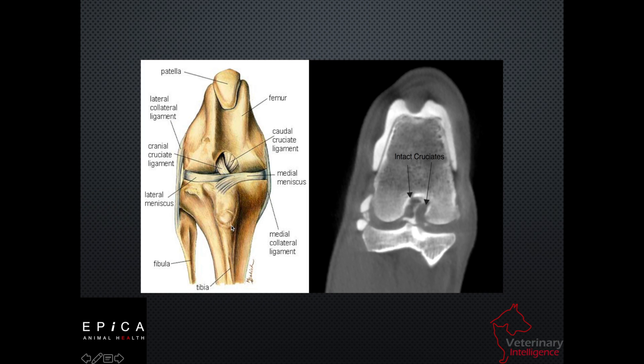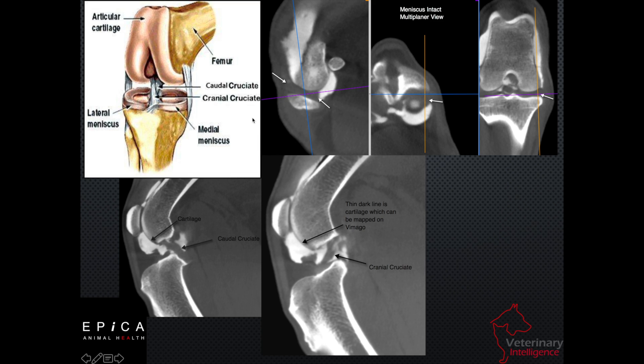The images we're going to see will reflect contrast material, which is going to be a really bright white. Darker areas inside the joint space indicate our soft tissue anatomy. We can identify intact cruciate ligaments in the center of the image, and from a lateral perspective we can get all three planes on screen at once — that's called multi-planar reconstruction view. We can also see our meniscus, whether or not it's intact, and whether our cranial or caudal cruciate are torn, partially torn, or intact.